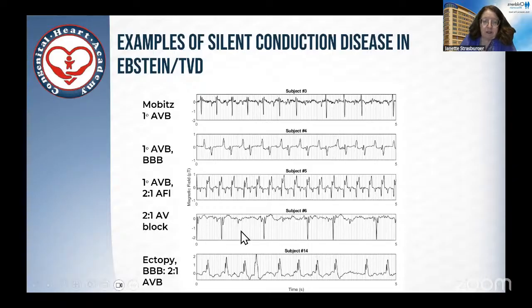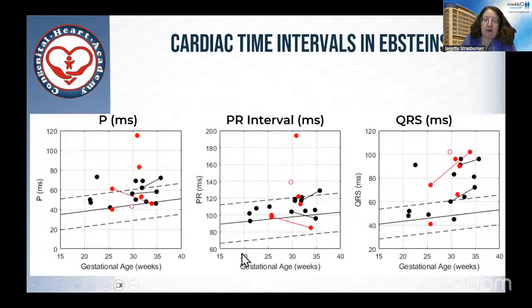This is a patient who exhibited some sinus bradycardia and second degree AV block. You can see here that this beat drops. There's a 2-to-1 block in this period. It's hard to know if this is type 2 or type 1, but it's probably type 1. Ectopy, again, here is another dropped beat. And so these patients are at risk for second degree and first degree AV block.